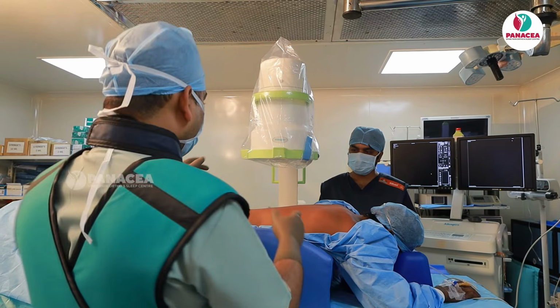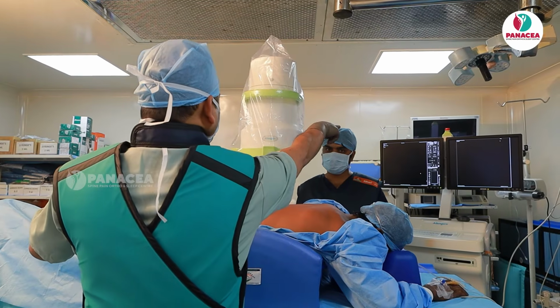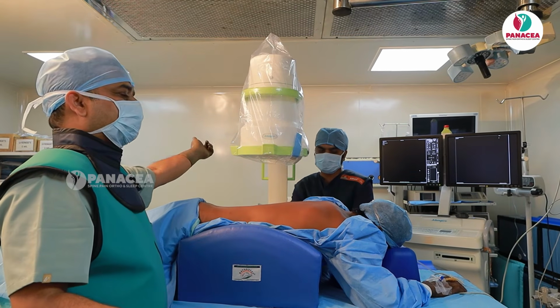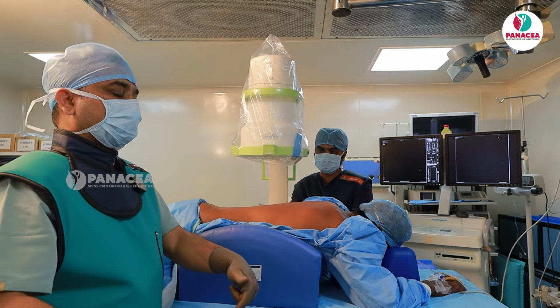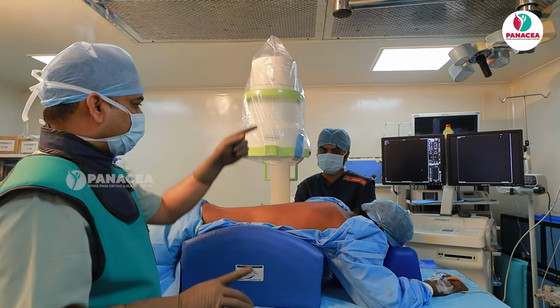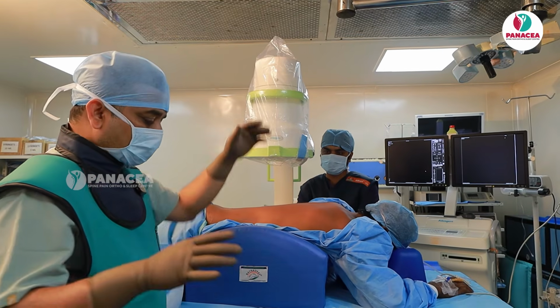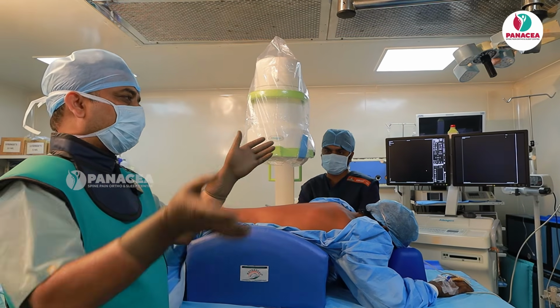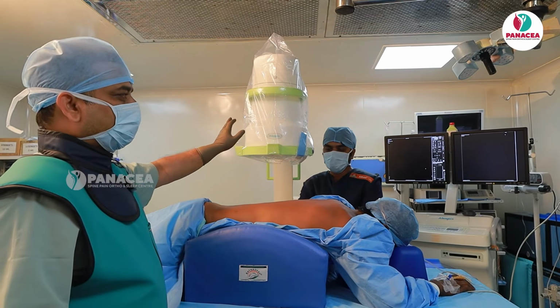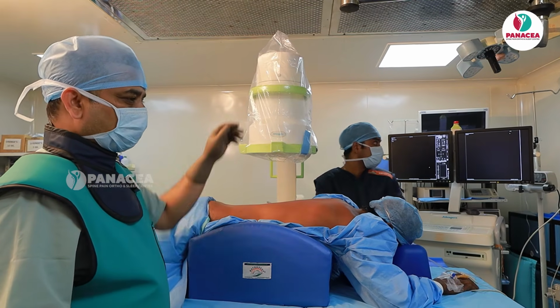So you should stand exactly opposite to the C-arm, so that you know this is ergonomics, and there comes the monitor, so that you can see the monitor, and it should be opposite. Since here in the patient we are doing the left side, the C-arm is also on the left side, the monitor is also on the left side, and you are standing on the right side. So this is mandatory. I will tell you why. Number one, if you want 30 or 35 degrees, you can take it. For example, if the C-arm is on the right side of the patient, you cannot go beyond 30 degrees. So there comes the problem. That's why the C-arm should be exactly on the side where you are doing it. So this is part of positioning.